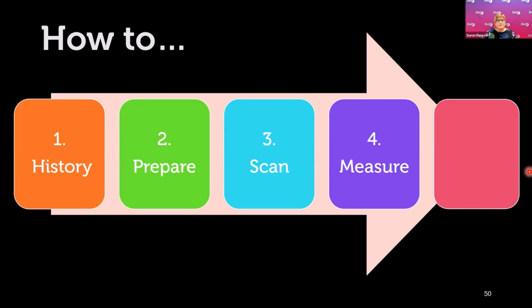The next thing we're going to do is measure. We need to end up with the length of the foreign body and a width, and if it's a big chunky one, the height of the foreign body. We also want to measure the depth from the skin surface to the foreign body so we know how deep it is in the tissue if you're surgically removing it. And last but not least, we've gone through the technique to mark the spot with a big X so that you can go back later and cut down and find this to retrieve the foreign body.